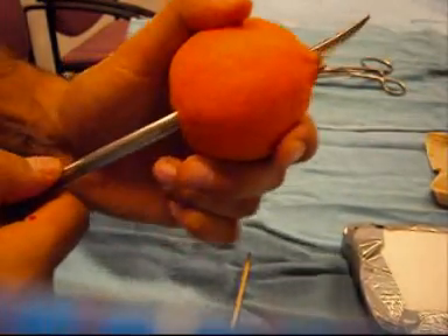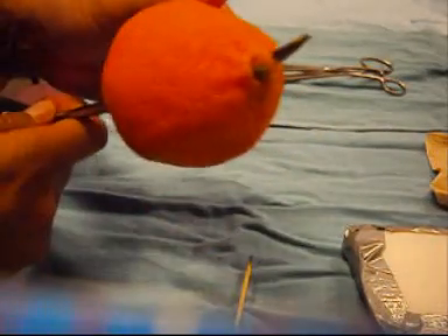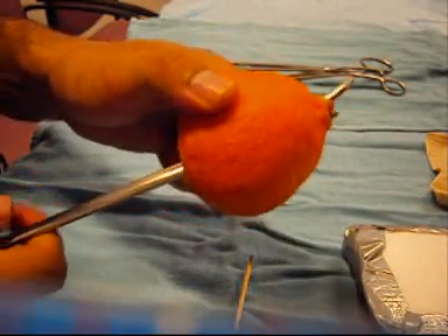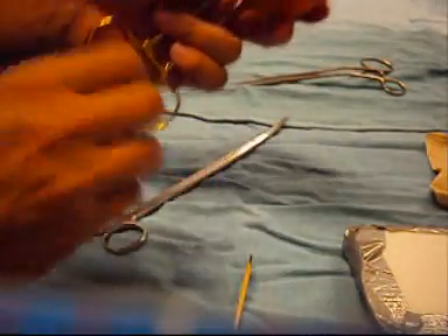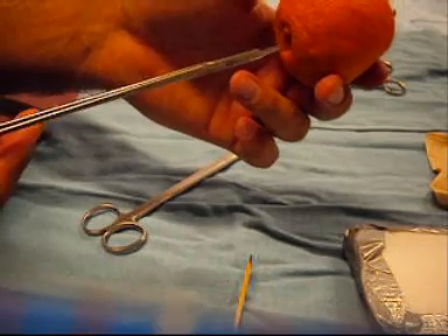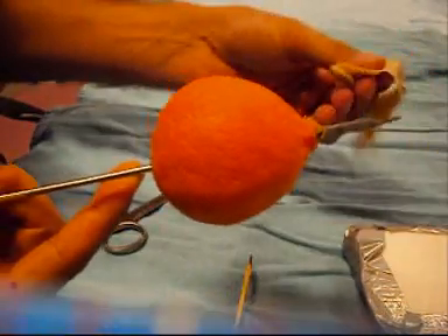Firstly, scissors are passed through the clementine as such, right through the centre if possible, as this will form the pathway for the urethra. We then replace this pair of scissors with a needle driver.